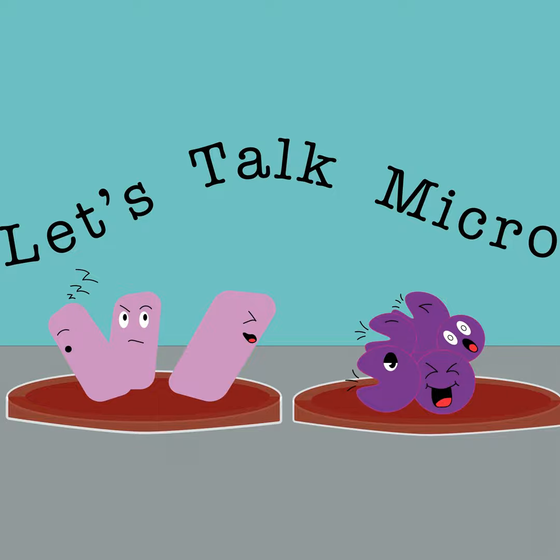So, in the textbooks, it is said that Moraxella catarrhalis is part of the respiratory flora. It is primarily seen in otitis media, sinusitis, and pneumonia. And I mentioned that I normally tend to see it in sinus cultures. So the colonies tend to be large and white, and then they slide over the agar when you touch them, which is called the hockey puck. Remember that. And I also mentioned that the ASM, American Society for Microbiology, says that it is classified as a mucosal pathogen. Eventually, it'll be updated on the textbooks.